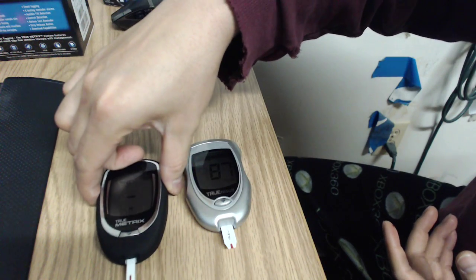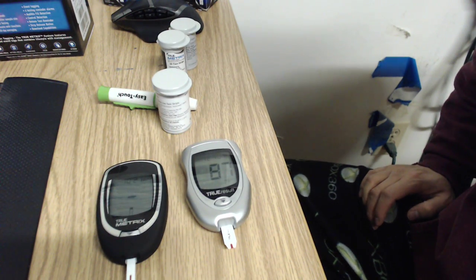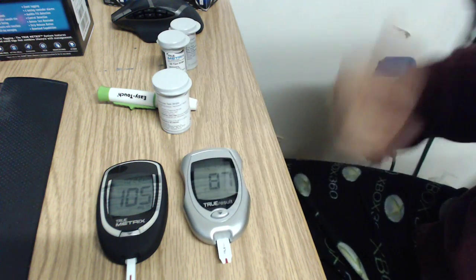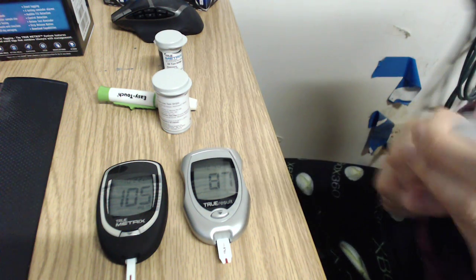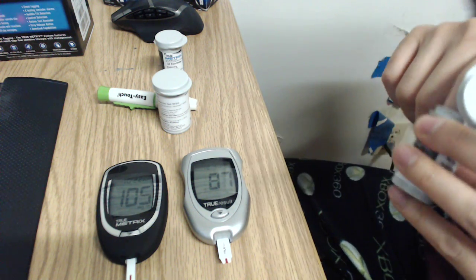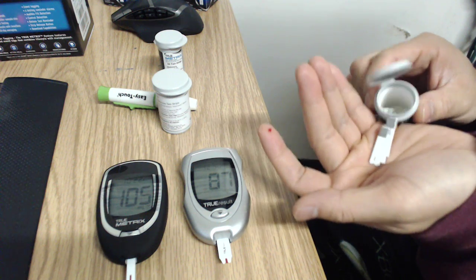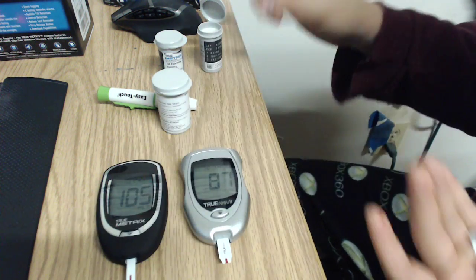Let's see if the True Metrix gives a similar or different result. 105 — that's pretty significant. Let's do the same finger, same blood on the True Test. I don't have many True Test strips left, but let me do one from this lot.